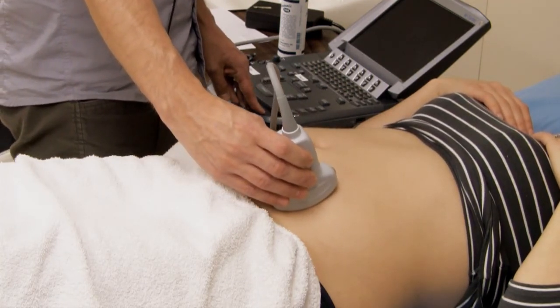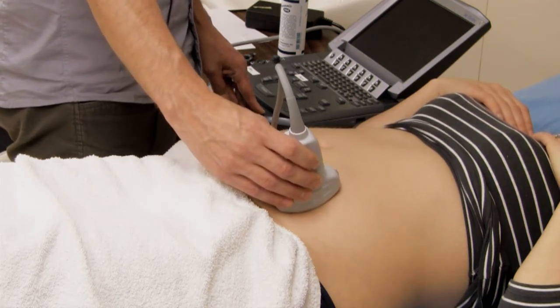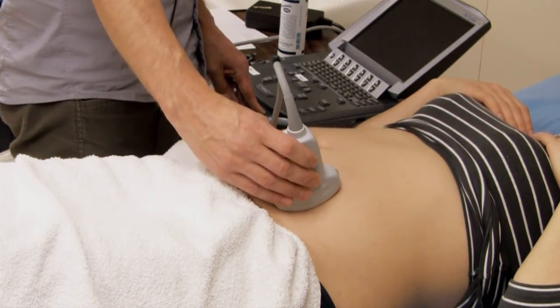This maneuver should have taken your probe completely around the maternal abdomen, and at this point you should be able to identify the fetal presentation.